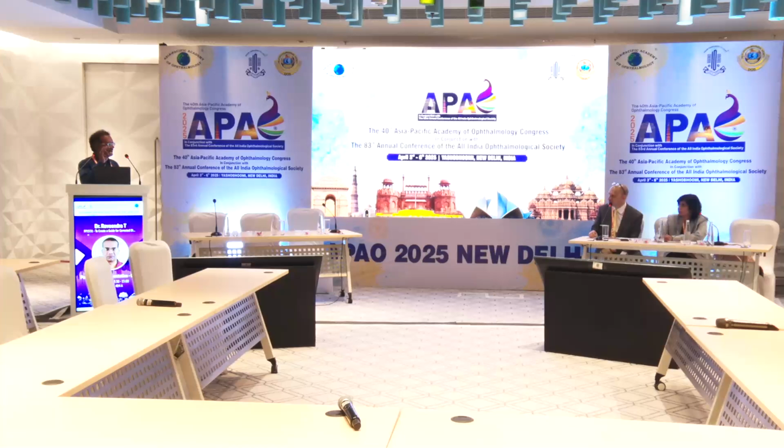The 1 millimeter spot is available in most of the slit lamps. And in some of the JAI slit lamps it will be 0.5 or 2 millimeter. So the nomograms will be required for the slit lamp that we are having. The reference diagrams will have to be customized. So we have the Topcon SL1E slit lamp where there is a 1 millimeter spot size, and in the JAI slit lamp we have 0.5 millimeter and then 2.